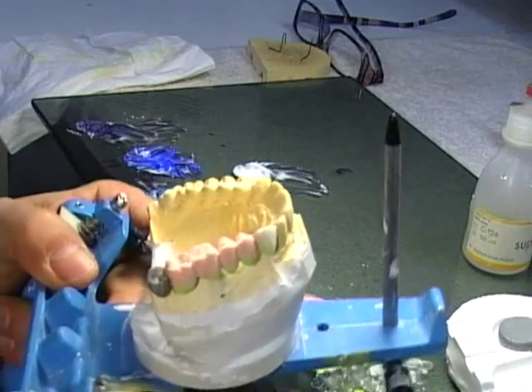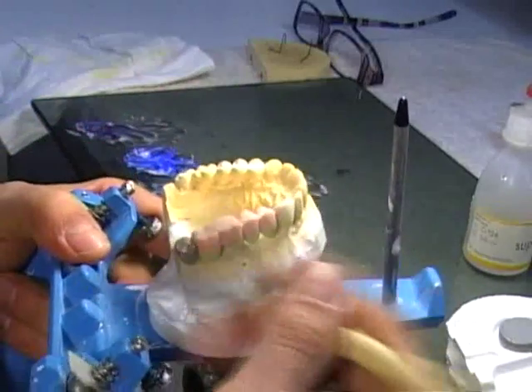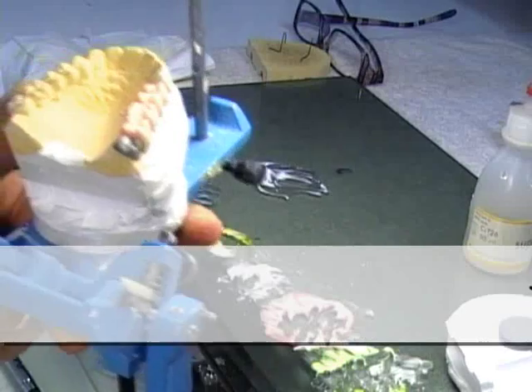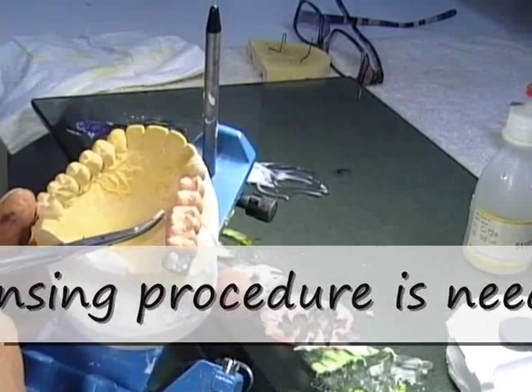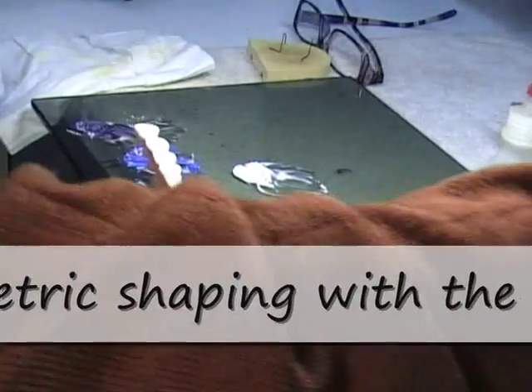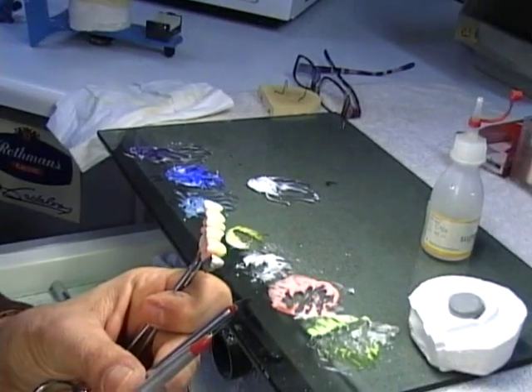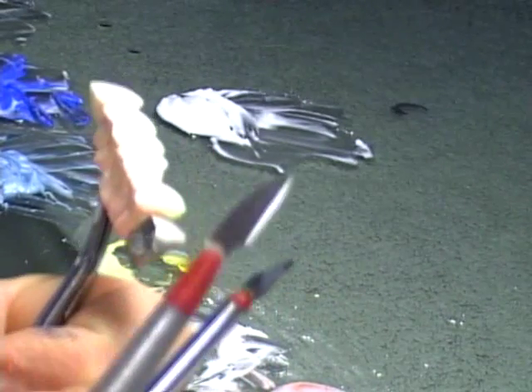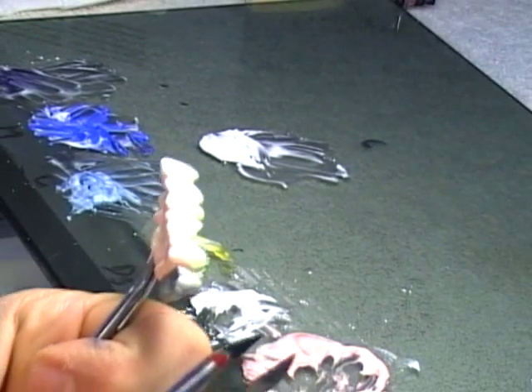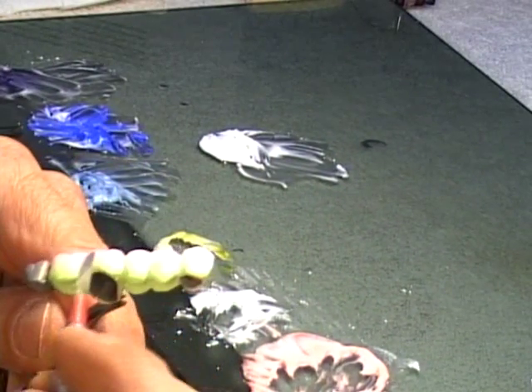Okay, so at this point I do just some brushing with my brush and I get ready for my cutback. When I do my cutback I can take this off the model and do it easily in my hands. Now to do my cutback I can use two different kinds of blades. I can use a bigger blade or a smaller blade depending on which areas I'm going to be getting the cut done.